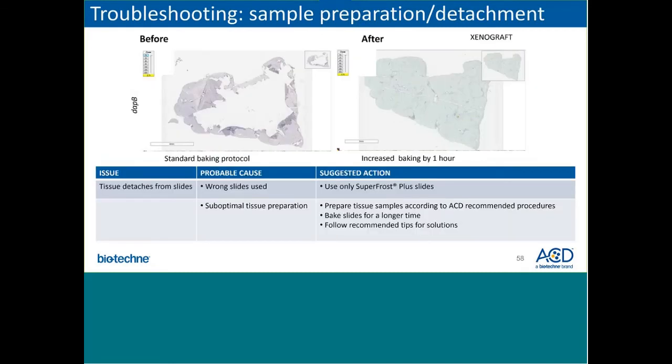Another common troubleshooting would be for sample detachment. In particular, we're looking at tissue detachment with a standard protocol. A potential cause could be that the wrong slides were used, in which case we would highly recommend using Superfrost Plus slides. This could also happen due to suboptimal tissue preparation.